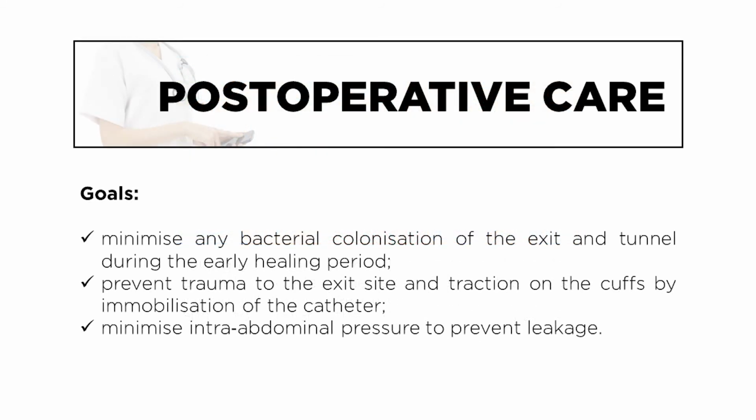The goals of post-operative care are to minimize any bacterial colonization of the exit site and tunnel during the early healing period, prevent trauma to the exit site through immobilization, and to minimize intra-abdominal pressure to prevent leakage.